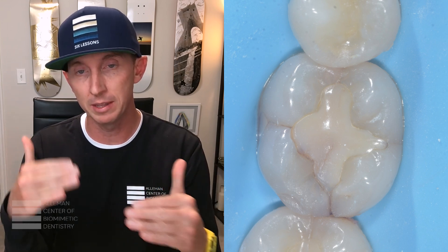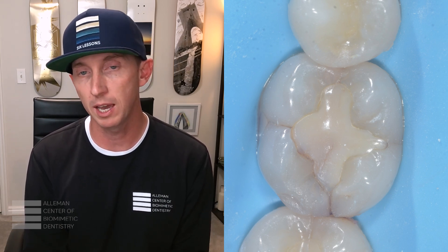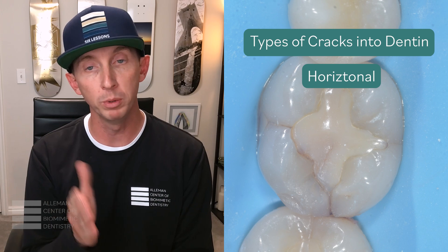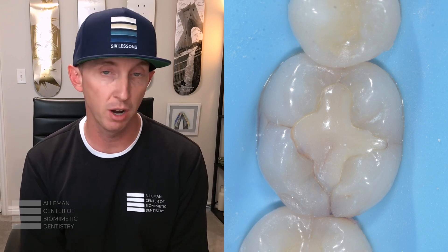On this tooth, we see a crack on the distal and the mesial marginal ridge, but we don't know the direction, length, or severity of this crack. In order to assess this, you actually have to open up the tooth and begin to see if the crack is moving horizontal, oblique, or vertical. Each of these cracks can have very different clinical failures, or in some instances, a catastrophic failure where the tooth is ultimately lost.